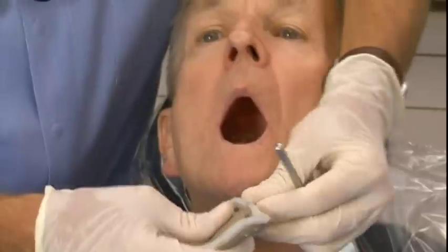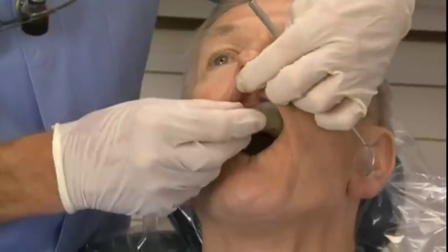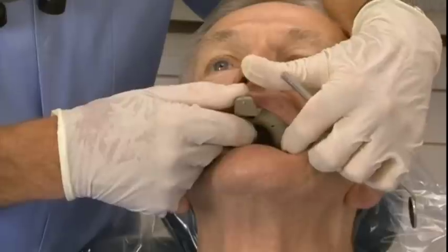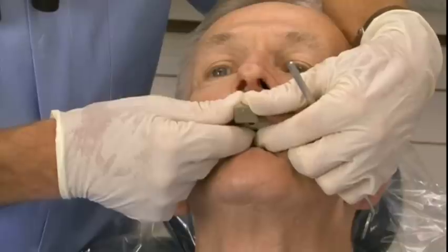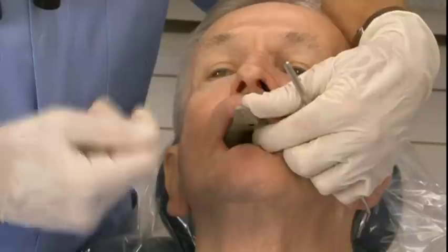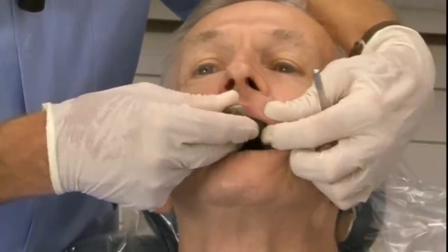Then I'm going to try the upper. Kathy's put some rope wax around the upper to create a little post dam. I'm going to have Mr. Bothy let his lower jaw relax and close a little bit. One of the reasons you can't get a big enough tray in some patients' mouths is that you run into the coronoid process of the mandible. If you get them to close a little bit, the tray can go back into that area and the mandible gets out of the way.